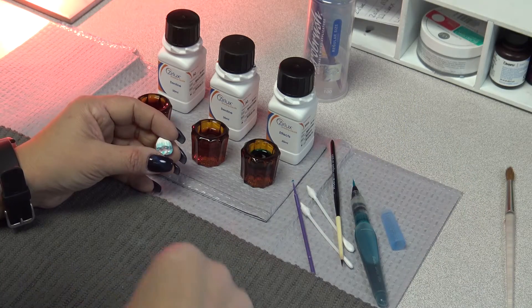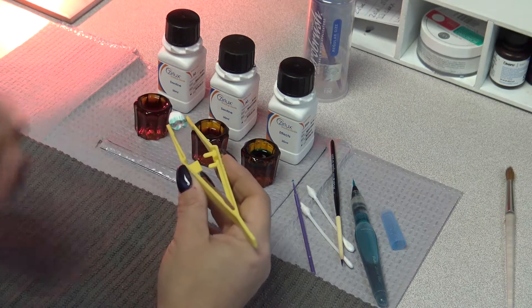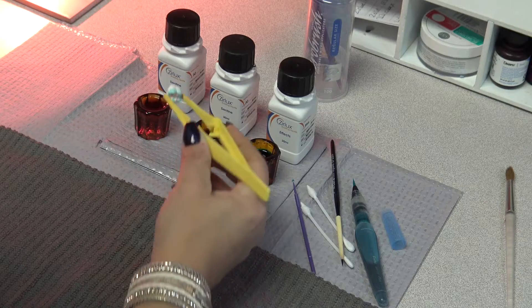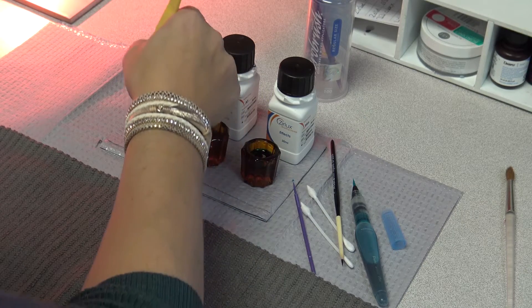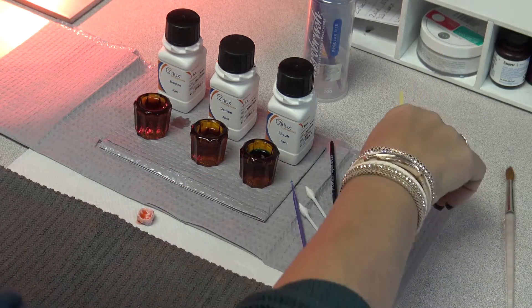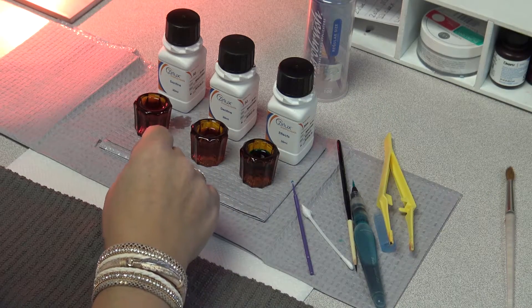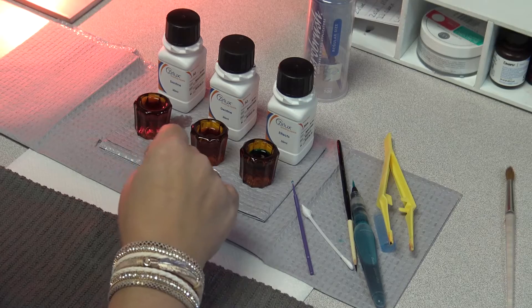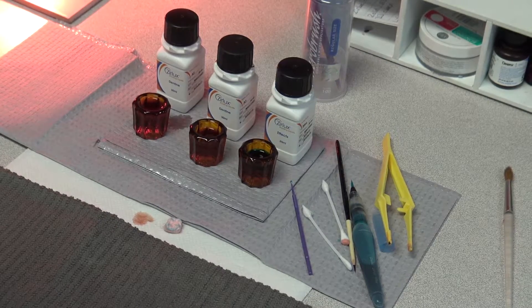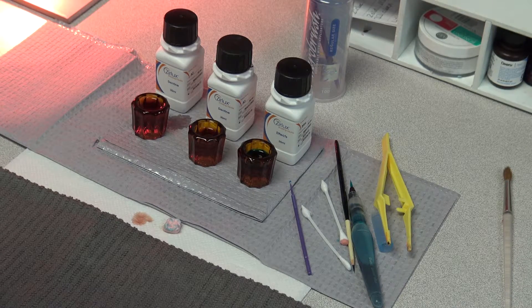Now we're going to take the crown using plastic tweezers — always — and dip it into the dentin shade A2 for two seconds, then take it right back out. We're going to blot it dry with a Q-tip and remove any excess puddles. Always make sure that you dip it in the dentin last. If you dip it first, all of the effect shades that you put on will not absorb in. Whatever you put on first is going to infiltrate your zirconia, so that's very important to remember.